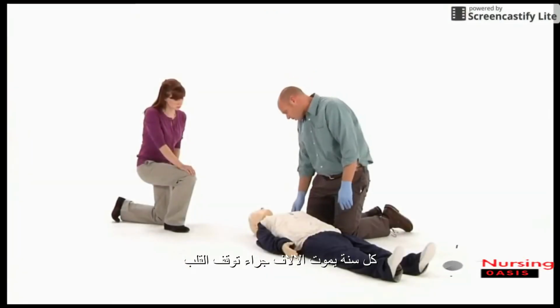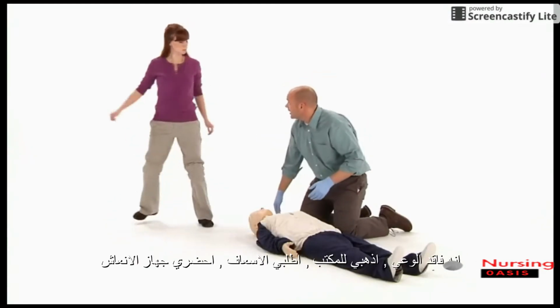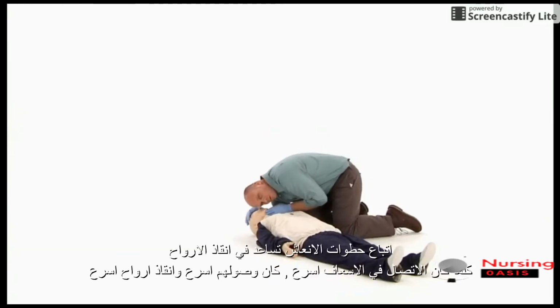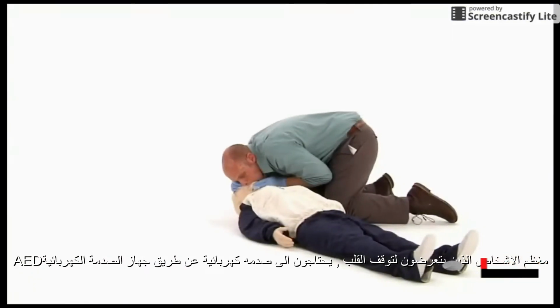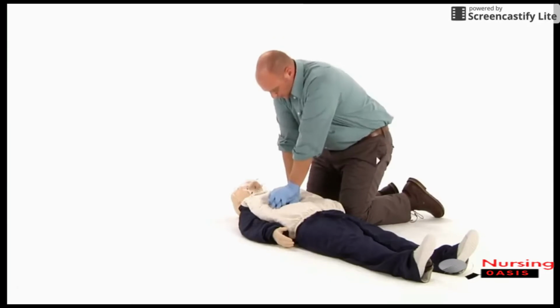Thousands of people die of sudden cardiac arrest. She's unconscious. Go to the front desk, call 911 and bring me the AED. Following the links of the cardiac chain of survival can help save lives. The sooner 911 is called, the sooner advanced medical care will arrive. Most people experiencing sudden cardiac arrest need an electrical shock called defibrillation.